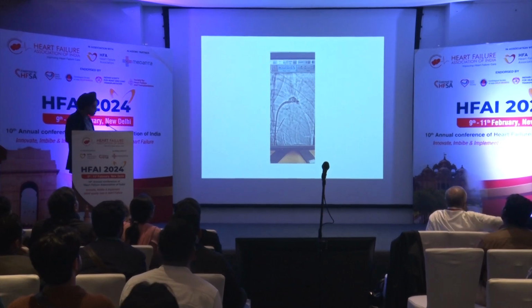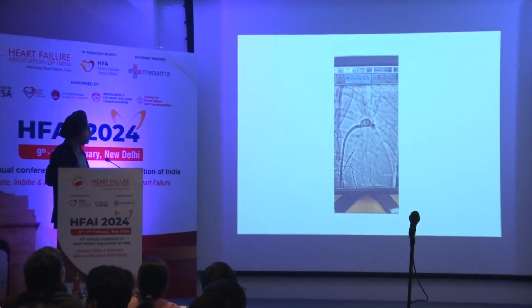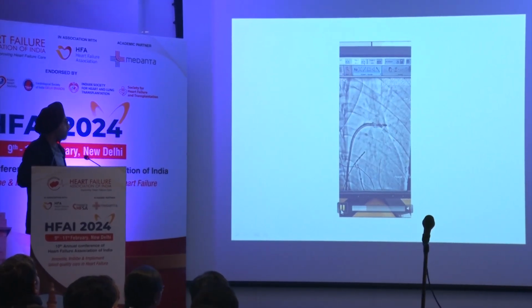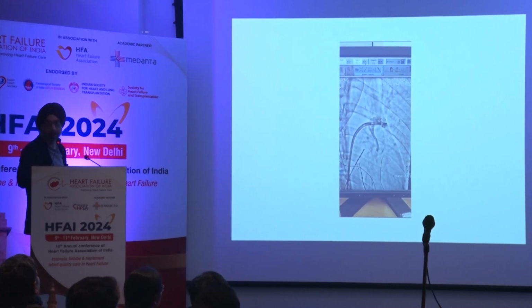So, can we play this? This is a video, please play. So we mapped it. I'm not showing you the map, but I'm showing you the catheter. So this is the catheter in the LA appendage. This tachycardia was coming from the tip of the LA appendage.